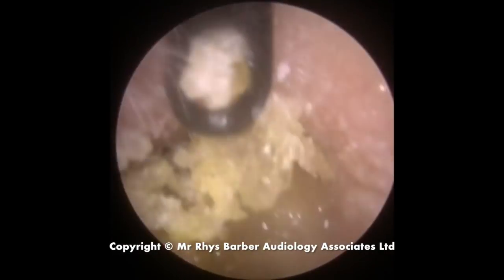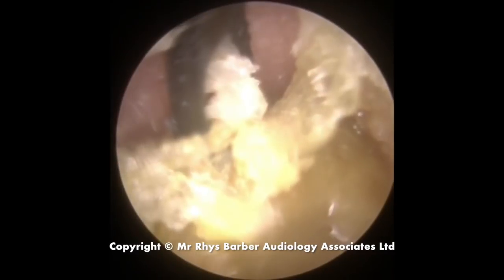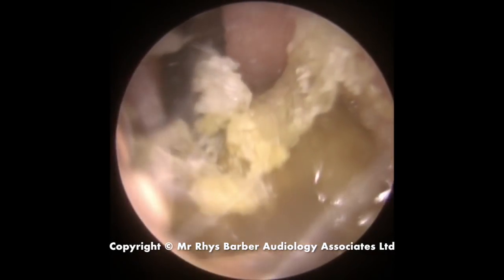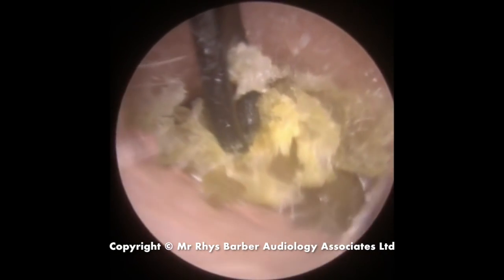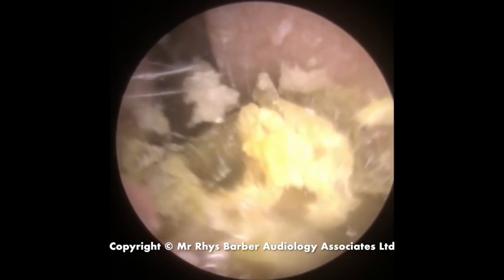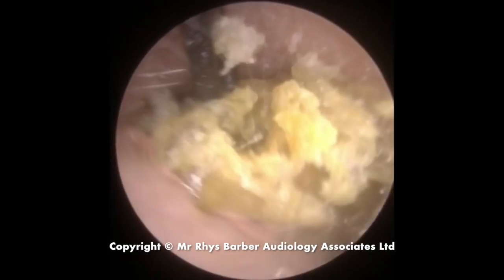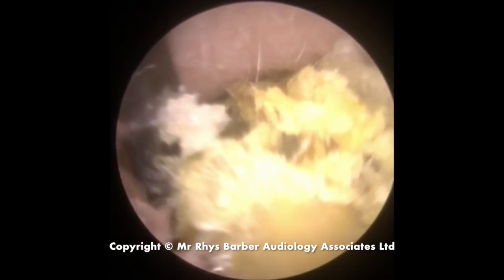You can see just how hard that wax is and how the Jobson horn is just clicking off the top of it while we're trying to get a good grip. With this type of wax, if you can just pull it out of the canal slightly, it's much easier to get behind it, then move to the next section and keep making the same movement to maneuver it out.